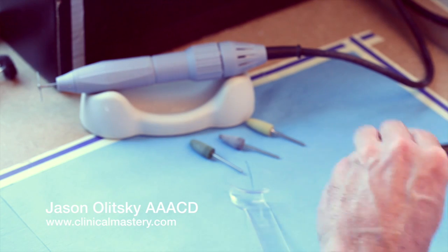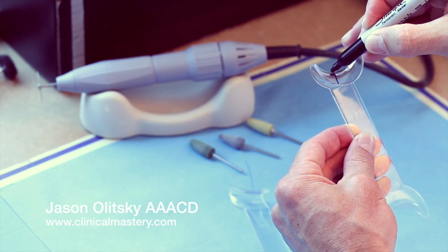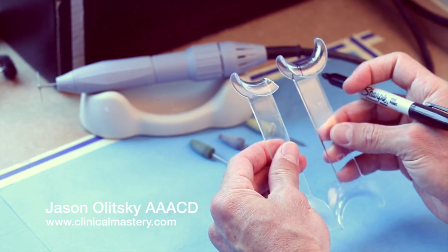I'm going to mark the side of the retractor I'm going to cut — just draw a line through it so I don't mess that up. I've messed it up before.